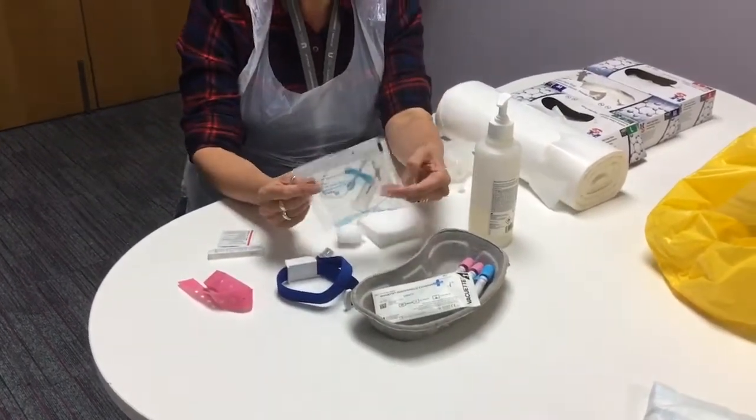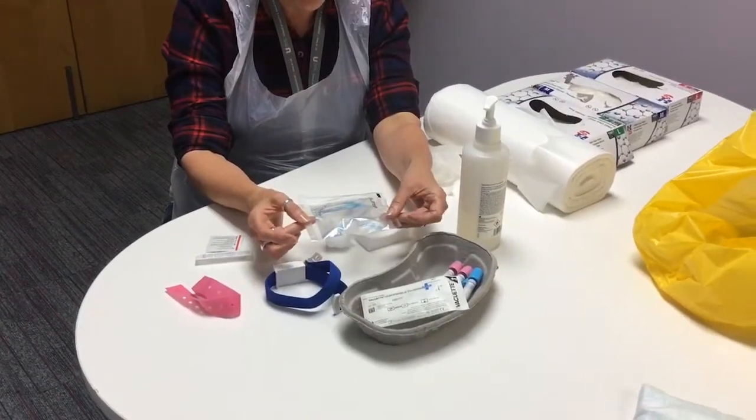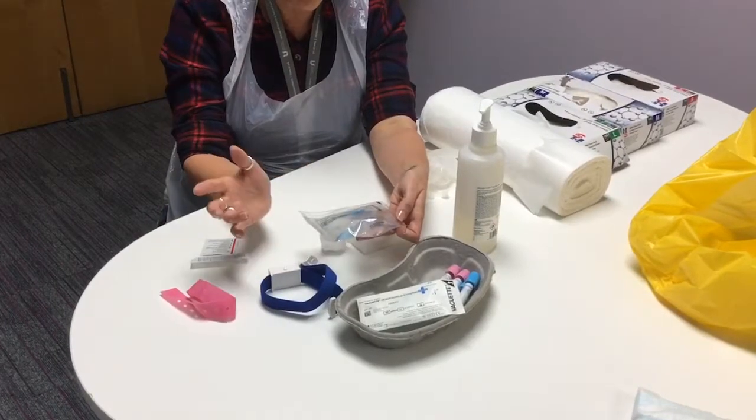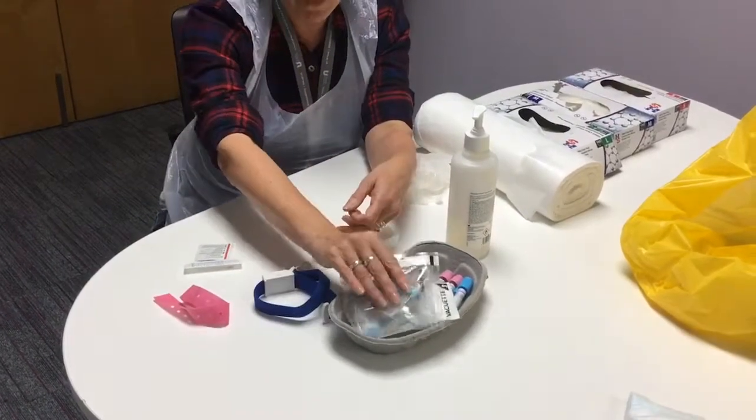If you're going to use a butterfly device, again check it's intact, check the expiry date, and before you come to use it, check everything's in working order. So again, this is the kit we're going to use for this.